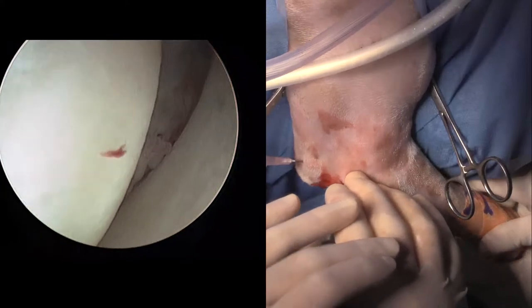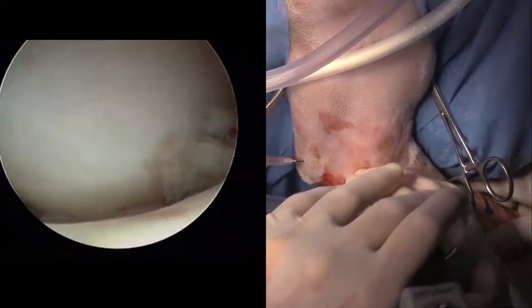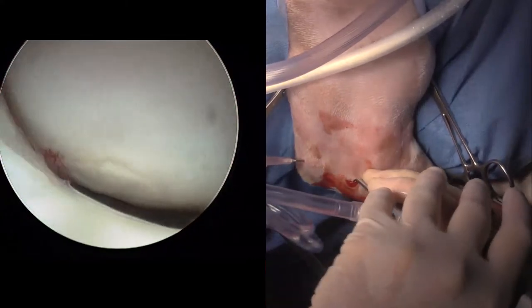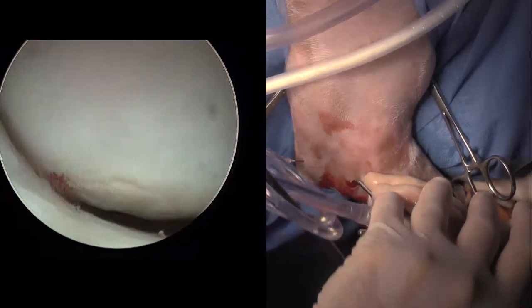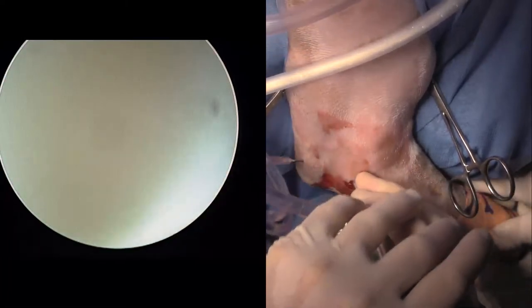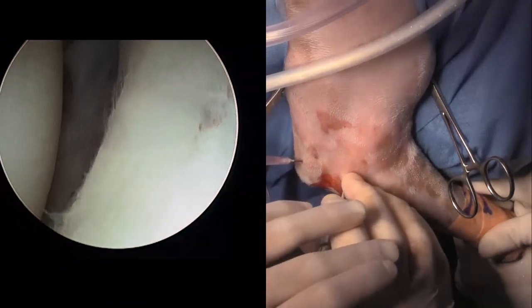So that's synovial proliferation on the other side. That's a semilunar notch coming up, coming around caudally. So that's the anconeus there, anconeal process. And there's not full thickness cartilage erosion in this joint, which is good. I was afraid that there was going to be.